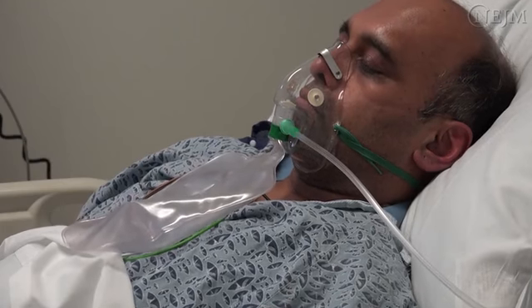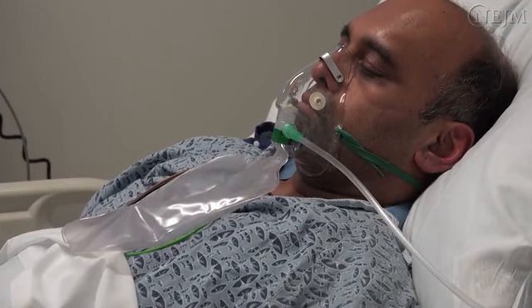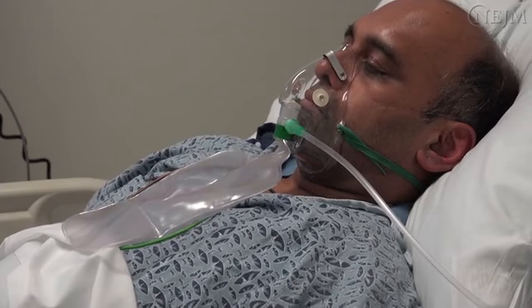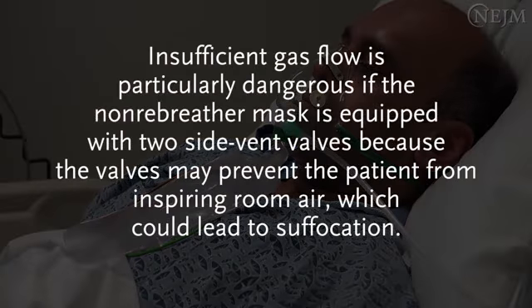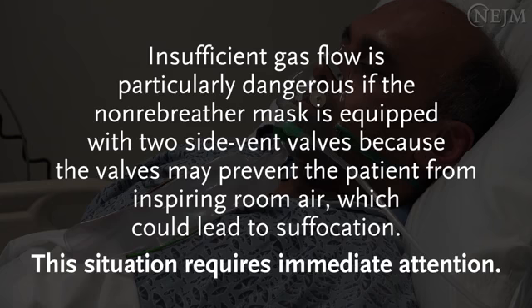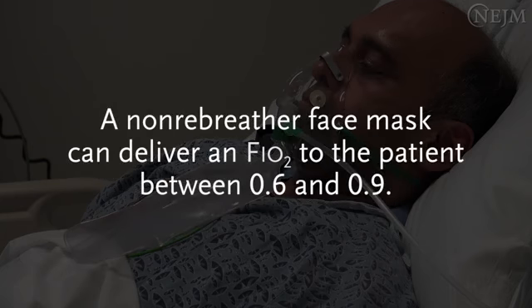The reservoir bag should deflate only partially during inspiration. Complete deflation of the bag indicates insufficient gas flow. Insufficient gas flow is particularly dangerous if the non-rebreather mask is equipped with 2 side vent valves, because the valves may prevent the patient from inspiring room air, which could lead to suffocation. This situation requires immediate attention. A non-rebreather face mask can deliver an FiO2 to the patient between 0.6 and 0.9.